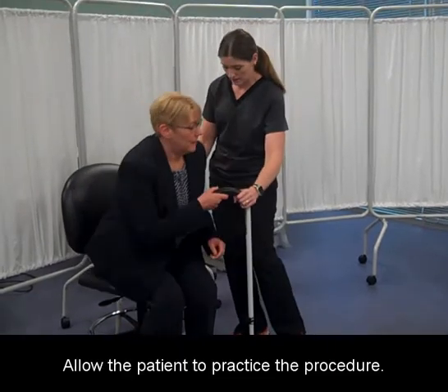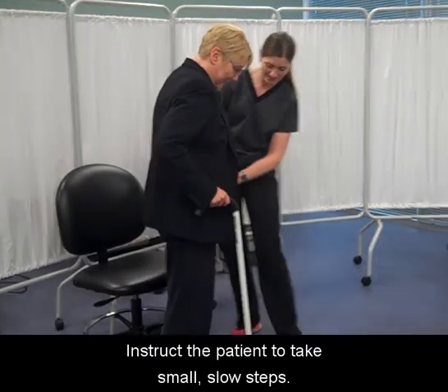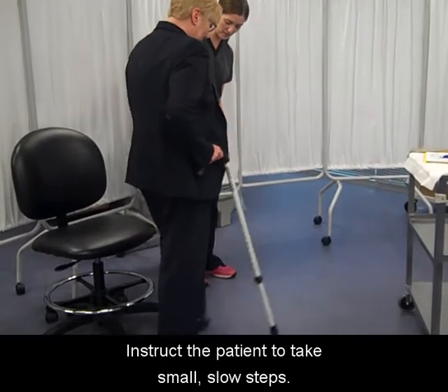Allow the patient to practice the procedure. Instruct the patient to take small, slow steps.